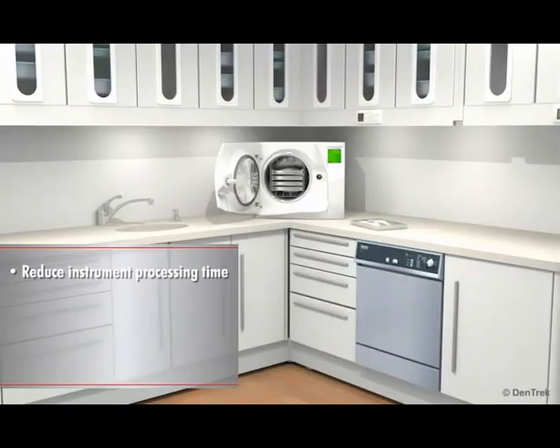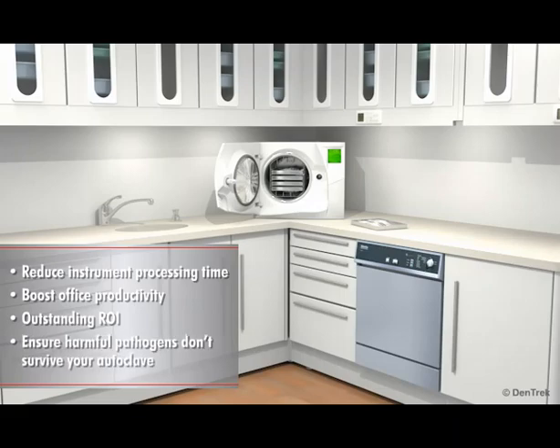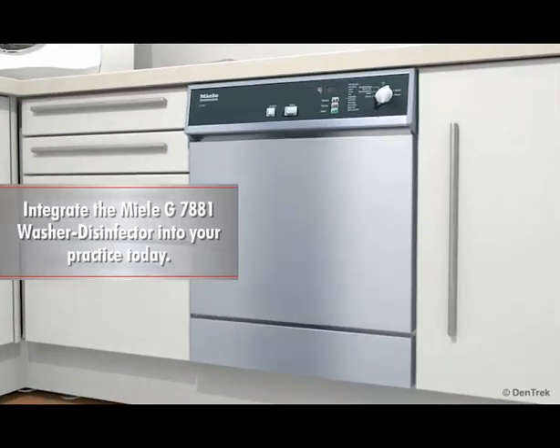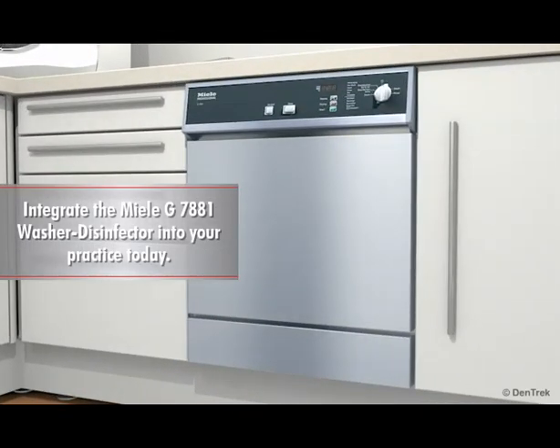Reduce instrument processing time, boost office productivity, take advantage of an outstanding ROI, and most importantly ensure that harmful pathogens don't survive your autoclave. Integrate the Miele G7881 Washer Disinfector into your practice today.